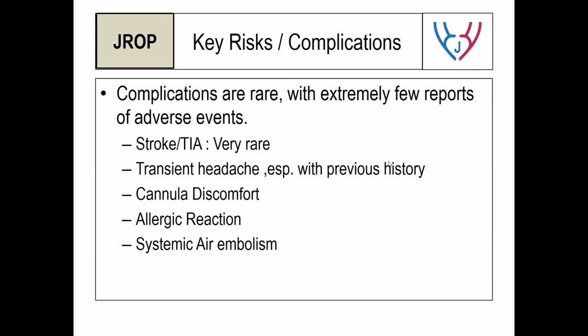Now the question comes, what is the complication or key risk? The complications are very rare, but they do happen. I can quote in my lab where we had a very interesting patient, which I'll share in a couple of minutes, with an unroofed coronary sinus. As we gave the contrast saline, what happened? The patient went into almost a collapse phase. The pulse dropped, the saturation dropped, the BP dropped. Why? Because these bubbles went into the coronary and cerebral circulations.